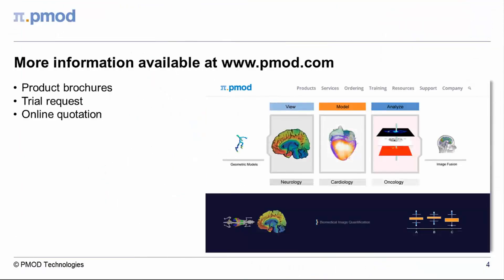In summary, the FUSE-IT tool supports the streamlined matching and post-processing of a large range of multimodality images, covering human and pre-clinical research applications. Trial installations are available to test the full functionality of PMOD and its tools. Please visit our website to learn more about FUSE-IT and other products from PMOD technologies. Thank you for your attention.